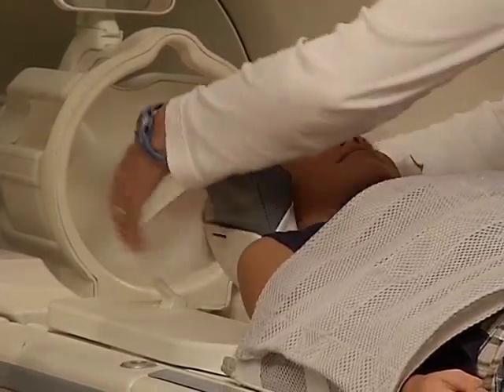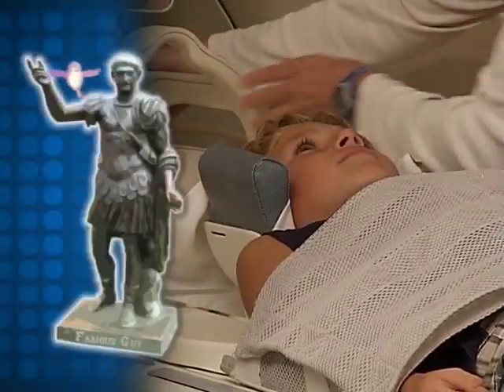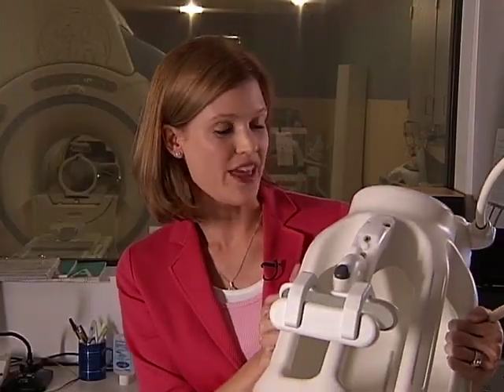Remember, you'll have to keep your head very still, just like a statue. Finally, your technologist will help put a helmet that looks just like this over your head.